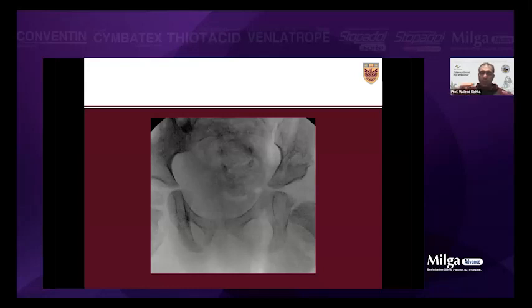And then get the spica table underneath. You lift the patient with them, get the spica table under, let the anesthesia guide this and lead this and count when you lift the patient up, so you can take care of the tube.